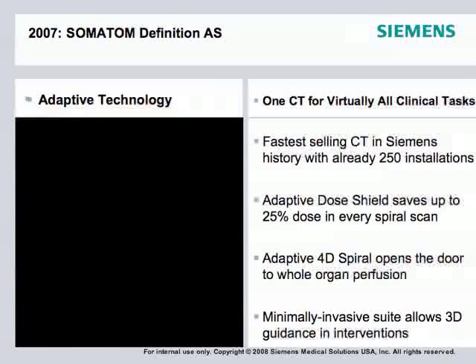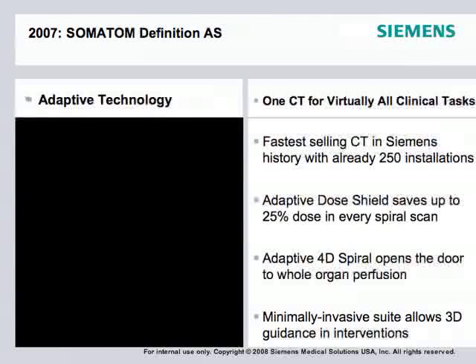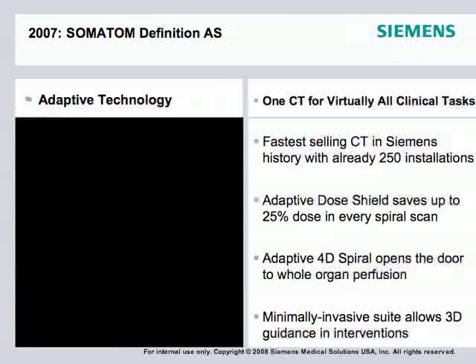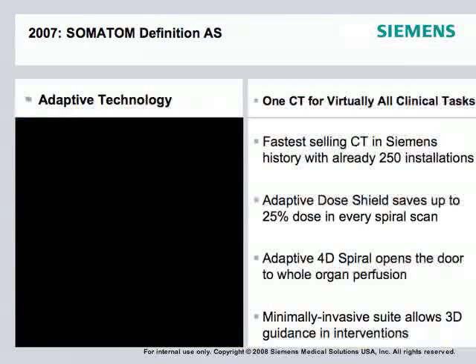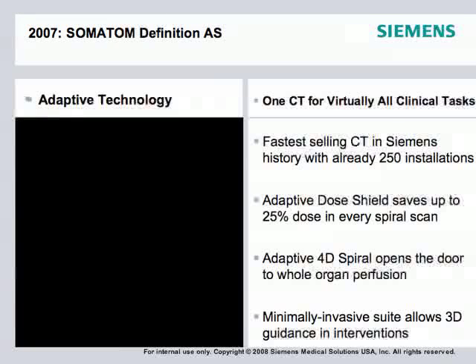3D guidance for interventions is available on any platform. In a Definition-class scanner, doing CT-guided interventions is very useful and increasingly needed in clinical practice. Getting true 3D color VRTs to map and manage interventions is important because it saves time. That brings us to the Somatom Definition Flash, where all of this technology is combined into one scanner.